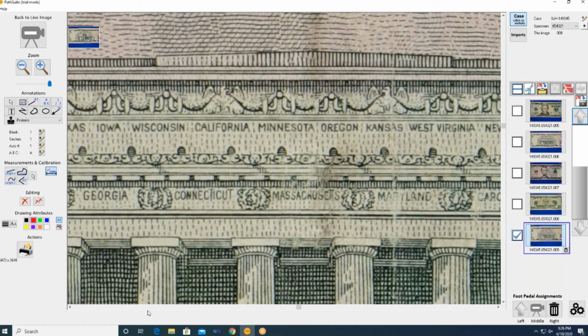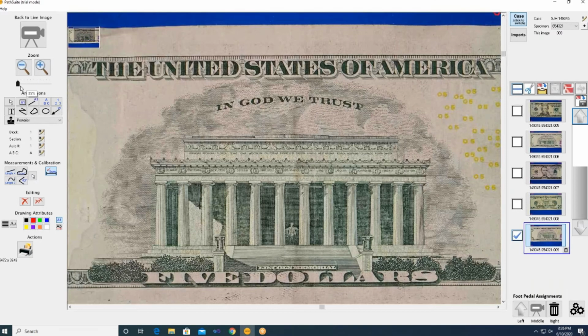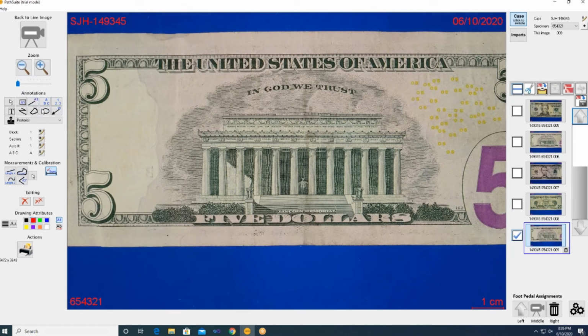So, all that said, you have the resolution that you need, and then if you look at here, we've changed all the tools so you've gone into our annotation mode. And with our annotation mode, you can do things like drawing blocks, like we had it set up for in the other mode. Generally we set it up for specimens being A, B, C, 1, 2, 3. They actually had it in the custom specimen drop down, and so we actually have this big number in there.